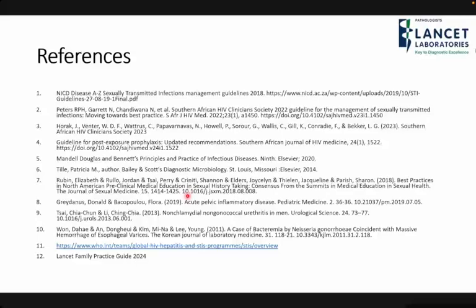I need to understand. Let's say, for example, I'm requesting a chlamydia or Neisseria gonorrhoeae NAAT test. Are you telling me that once it is detected that there is a presence of chlamydia or gonorrhoea, you will not be able to do the next step, to tell what this gonorrhoea is sensitive to? So the NAAT test is simply to identify the presence of the organism. It will not indicate that it is sensitive to your primary antibiotic of choice for this organism. Can you just clarify, because the next question would be, would the multiplex panel also do the same thing or not? Thank you. If you can just clarify that question, then I think I just have one more question.